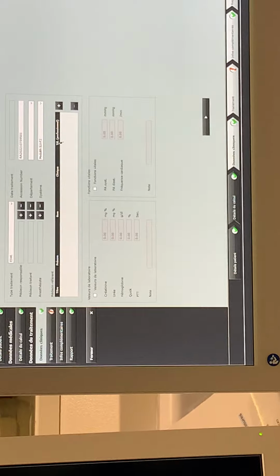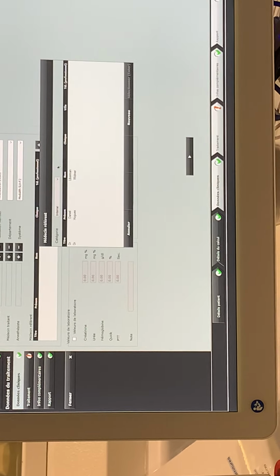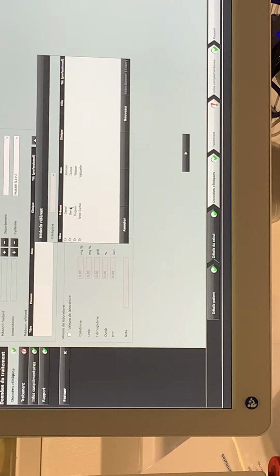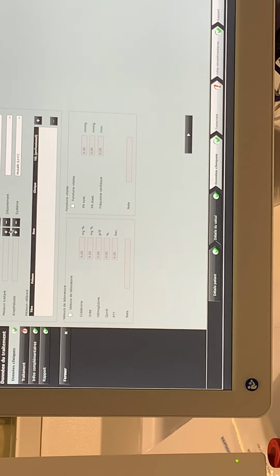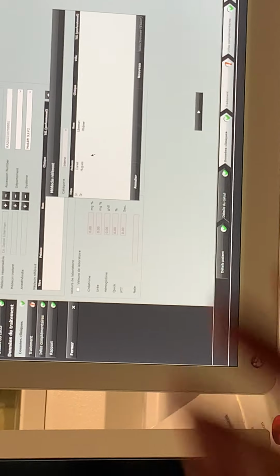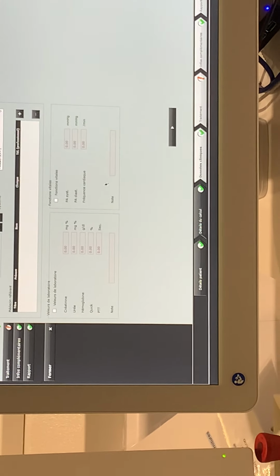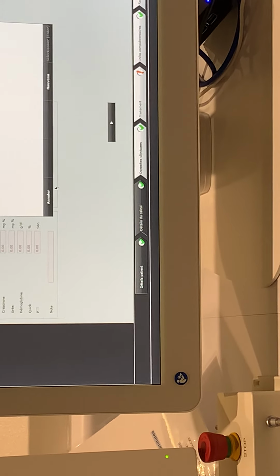If we go on to the next one, we have some clinic details. For example, you can enter here the responsible doctor. We have internal, external. For example, that was for today. We have, my French is not so good, I do not speak French, but treating physician. Yes, the treating physician, that most of the time is you as a doctor. So we have to add ourselves? Yes, you can press plus and make a new one.